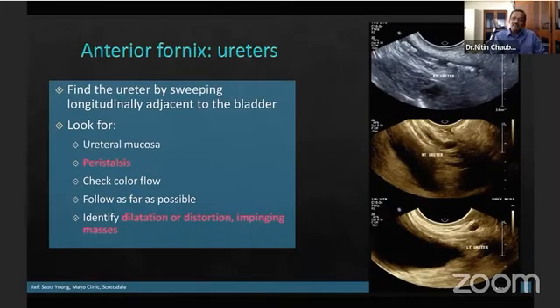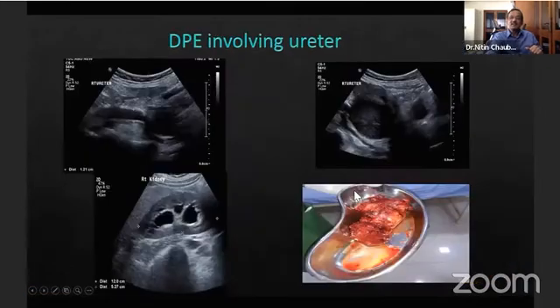Now, typically as radiologists, we are used to looking at ureters transvaginally. This is because very often in a female, when we want to search for lower ureteric calculi like this, we do a transvaginal scan. And therefore, when you have a slightly full bladder, as I said, we don't empty the bladder when you're looking for endometriosis. We keep the bladder slightly full, and we can see the lower end of the ureter. And if there's a patch there, that can be again picked up.